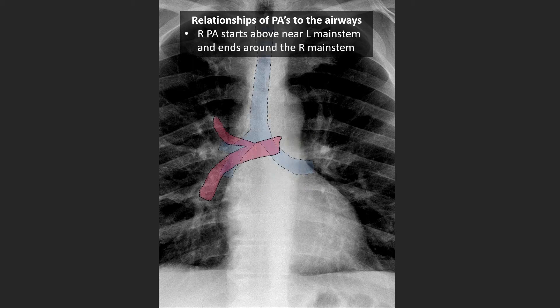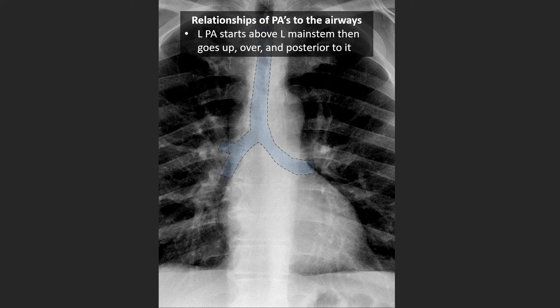The right pulmonary artery begins just at the level of the mid left main stem bronchus and terminates at the level of the mid or proximal right main stem airway — we expect it to be in this area here. The left pulmonary artery is always going to be above the left main stem airway, beginning about halfway through it and terminating out in the hilar area — we expect it to be just above the left main stem airway in this area here.